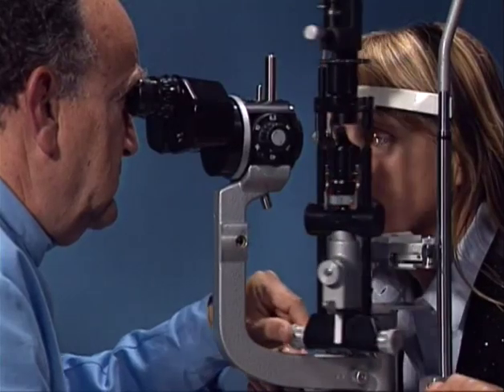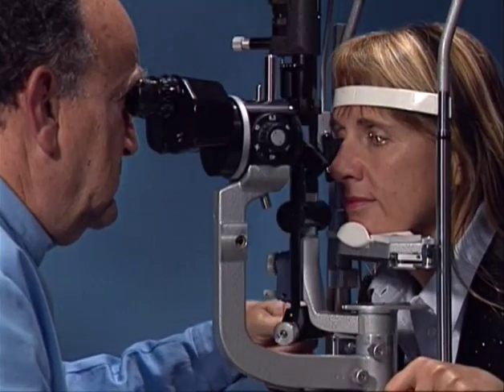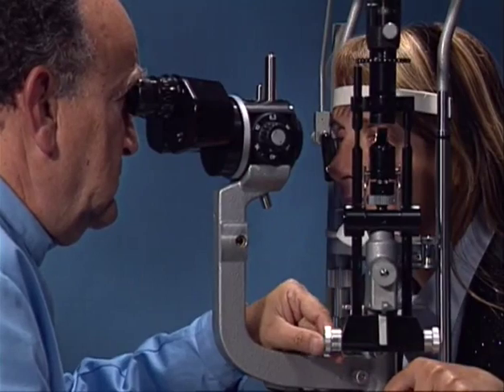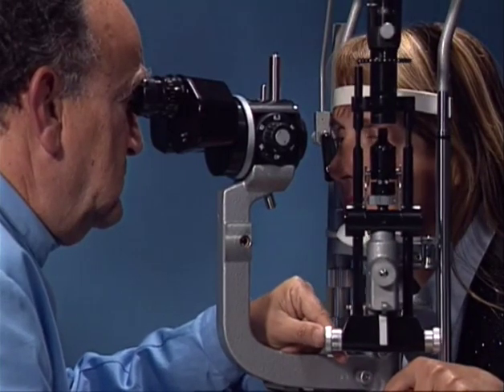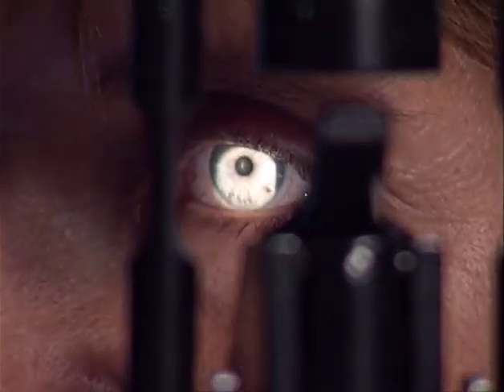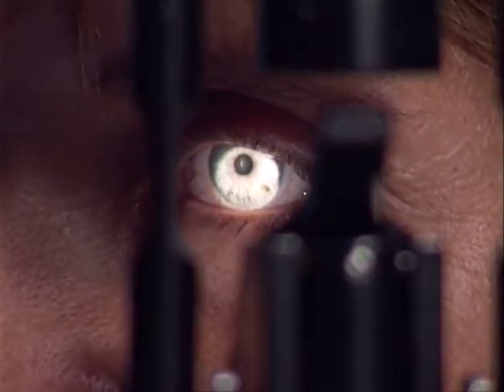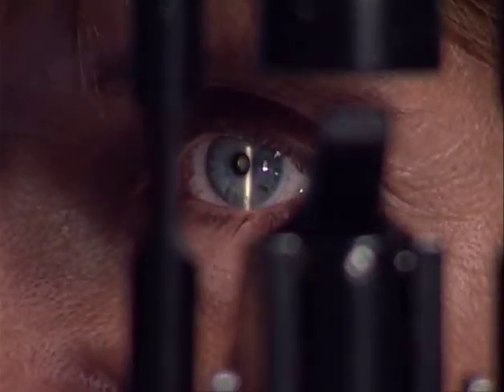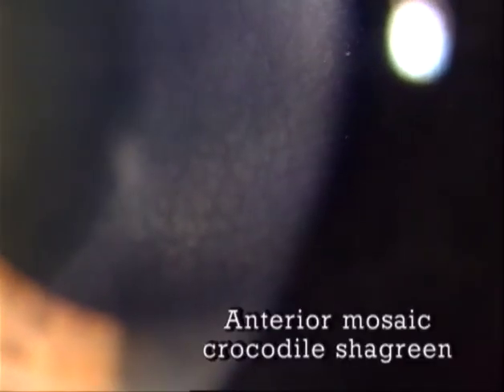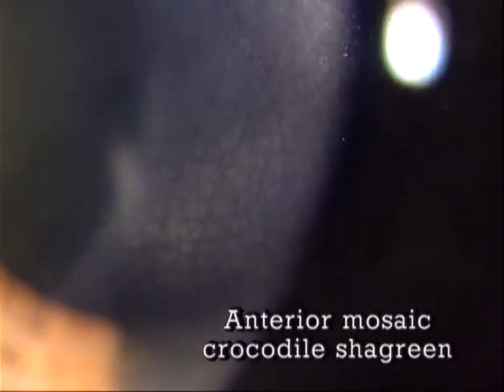The incessant change of illumination methods needed for a proper examination requires versatile slit lamps designed for easy variation of illumination angles. Just as important is an easy variability of the light beam shape. When searching for lesions within a large field, obviously a wide beam is needed, as shown here in the example of an anterior mosaic crocodile shagreen in the cornea.